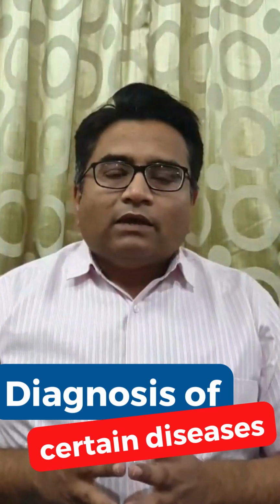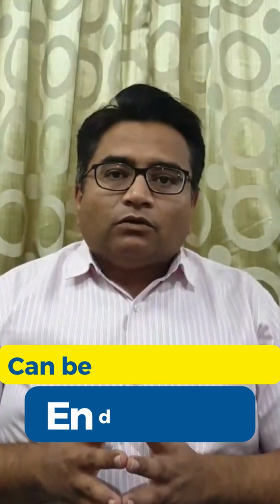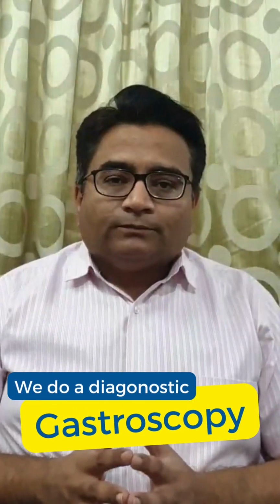So when we do it for the diagnosis of certain disease, like when a patient presents with certain symptoms like dysphagia, vomiting, or there is a suspected disease for which the diagnosis is required and it can be done only through the endoscopy, or there are certain tests which are ordered by a physician or a surgeon and they turn out to be abnormal, and to find out the cause of those abnormal tests and to perform a biopsy for the diagnosis of certain diseases like cancer, we do a diagnostic gastroscopy.